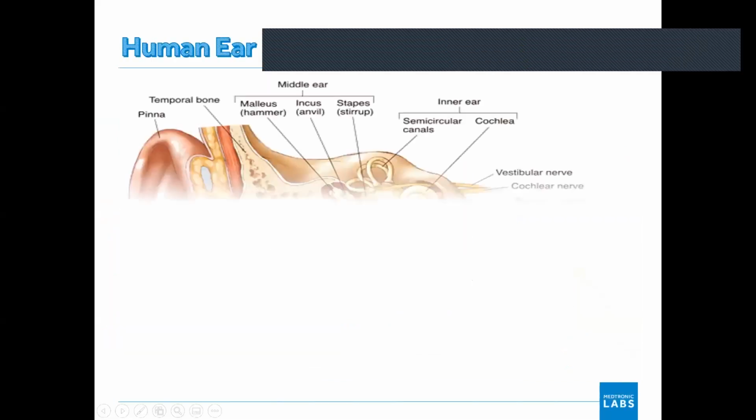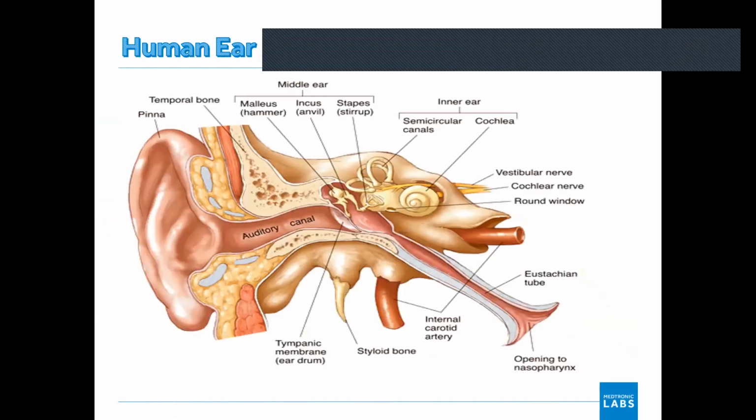So this is ear anatomy, which contains the information regarding what all the parts are and how they work, what all the diseases are which happen to the particular parts, and what diagnosis we have to provide to the patient, those who are having an ear related issue.